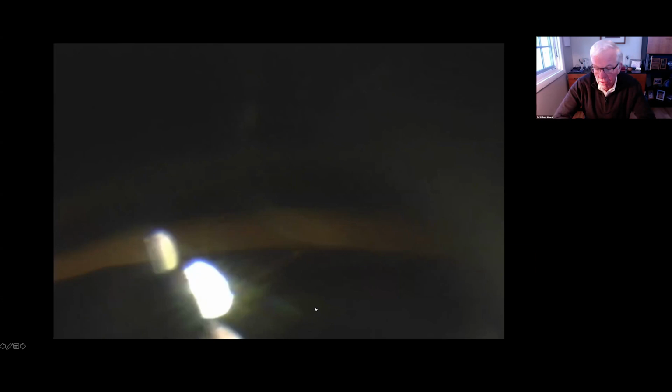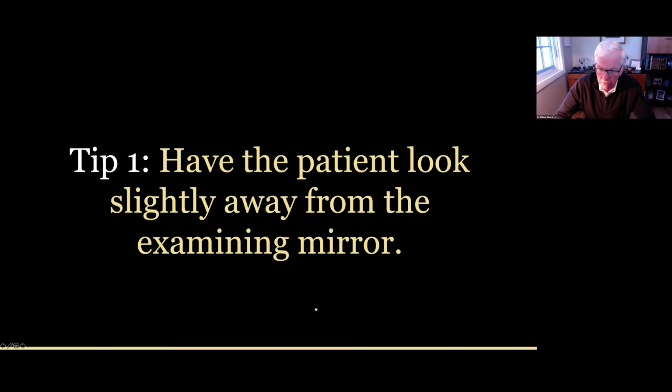So tip number one, I struggled with this. In fact, when Mr. Allen, the guy who did all that great artwork, was alive, I asked him how he always found a corneal wedge, because it's always in every one of his paintings. And what he told me to do, which is hugely helpful, is to have the patient look slightly away from the examining mirror, right?